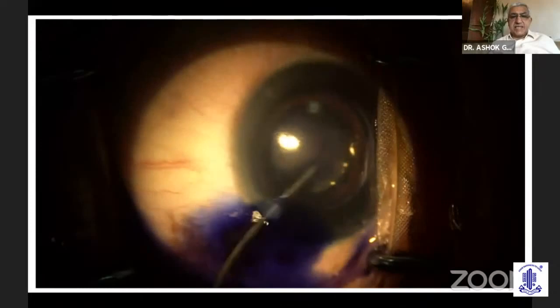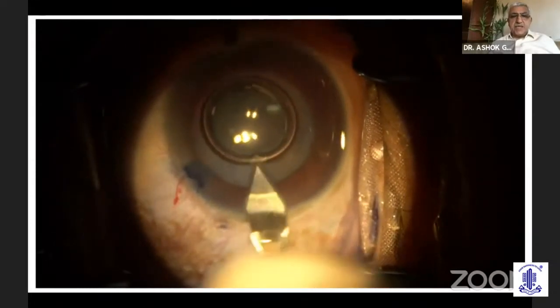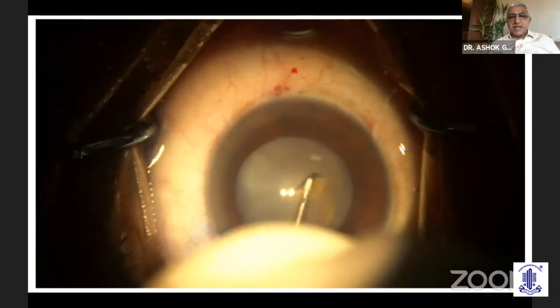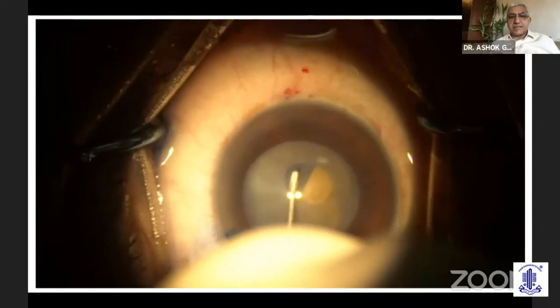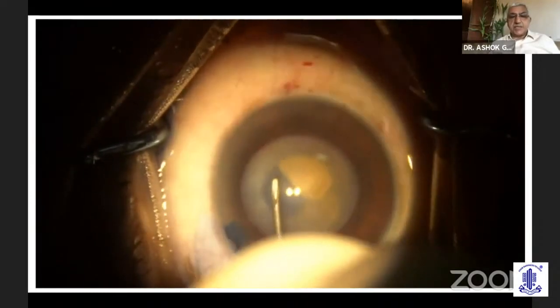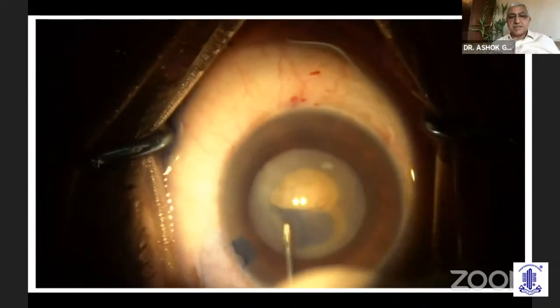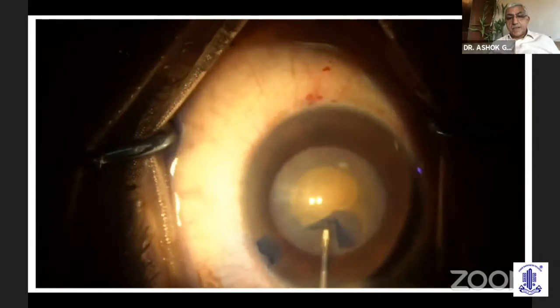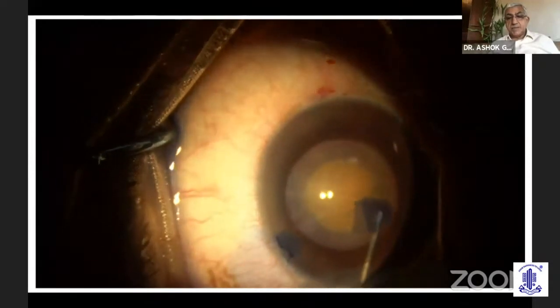and we are doing a staining because it is a white cataract. And then we proceed. It's a hard, nucleus grade 4 to 5 cataract. So we are starting with a relatively small rhexis, thinking of a possible raised intralenticular pressure and a more cautious approach, small bites and small extensions of the rhexis gradually all around. So this is about 4 at this moment, 4.5.